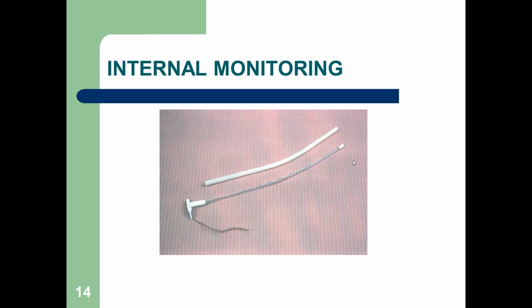This is a picture of internal monitoring. And again, the physician or the nurse midwife places this. And sometimes they also include a fetal scalp electrode, okay? You have to have special training in order to insert these, okay?